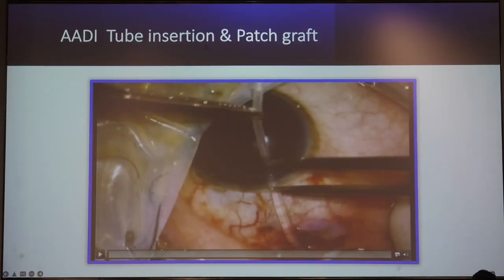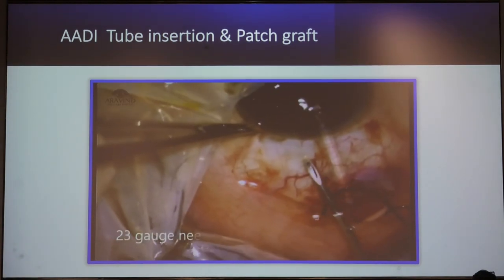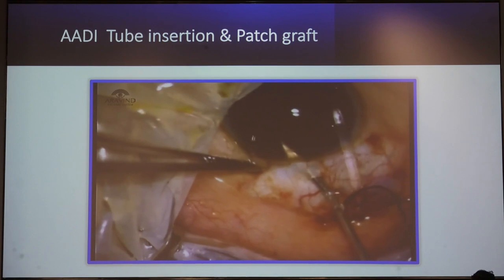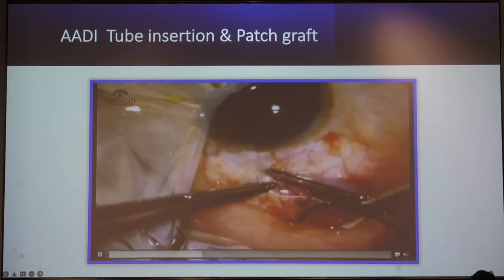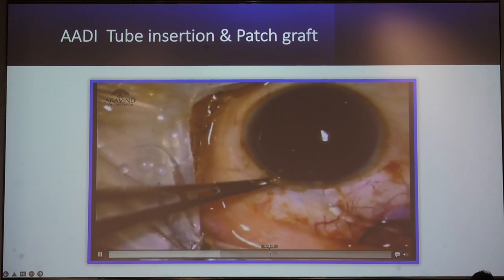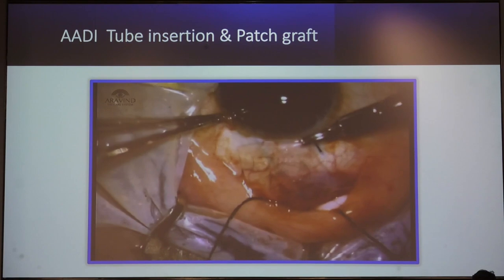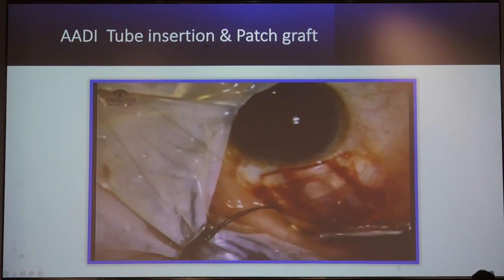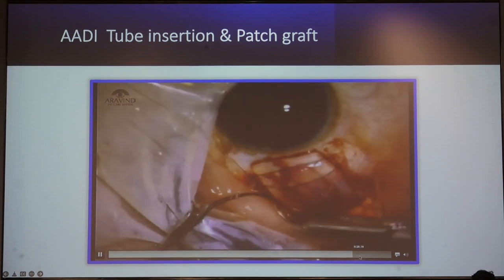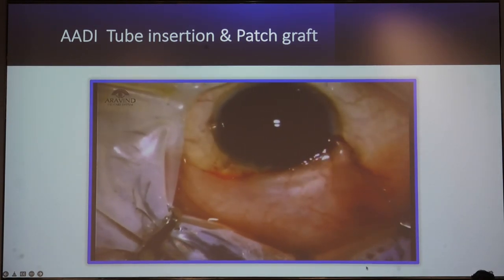In cases where a patch graft is available, the same approach is used. Mark the tube, and the bevel should be facing up. Cut the tube at a 45-degree angle so you get a nice bevel-up position. The tube is then inserted into the anterior chamber. After inserting, take a partial-thickness corneal patch graft, and the patch graft is anchored with 10-0 nylon suture. Conjunctival closure is then done in a similar fashion.